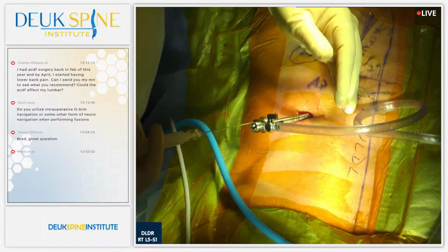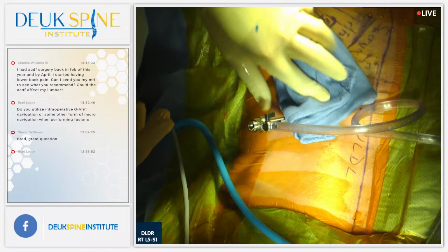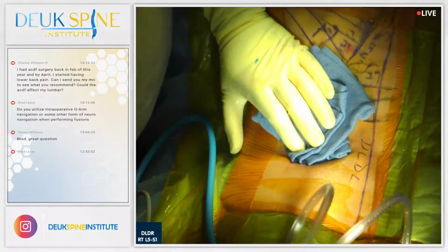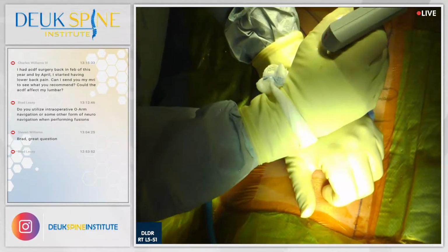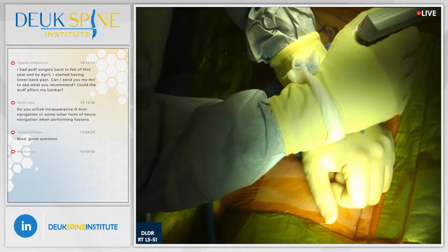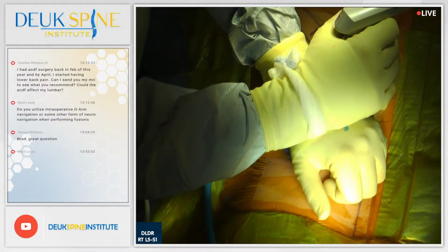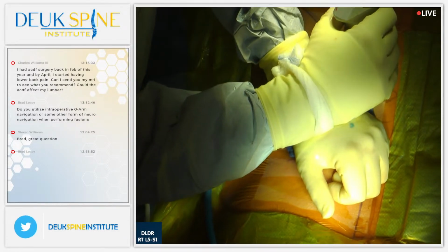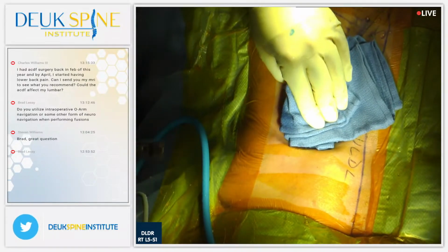And I never use an O-arm because it's unnecessary, it's dangerous, it emits a tremendous amount of radiation. It hurts the patients, hurts the staff. Most of the staff get out of the room. They won't even stay in the operating room when the O-arm is on. It's like a CAT scan in the operating room, and the patient gets fried. I would not want the O-arm if I was a patient. If my surgeon said we're going to use the O-arm, I would leave and find another surgeon like me who doesn't need it.